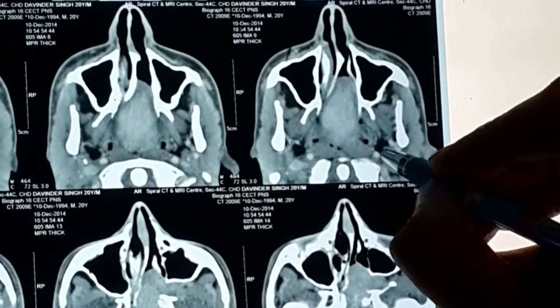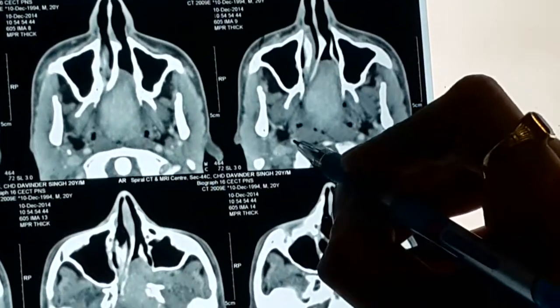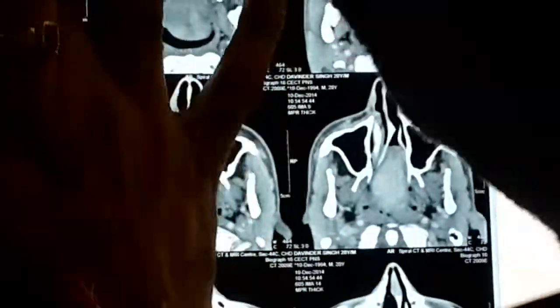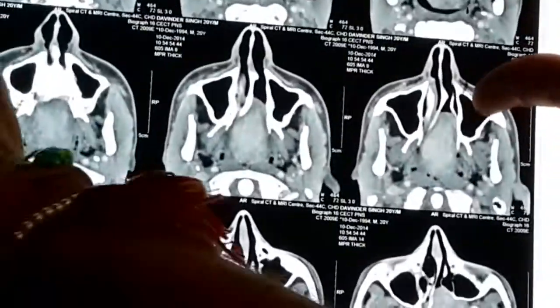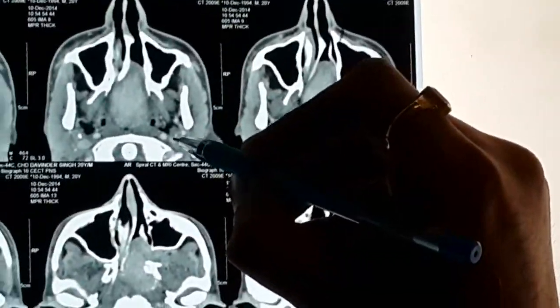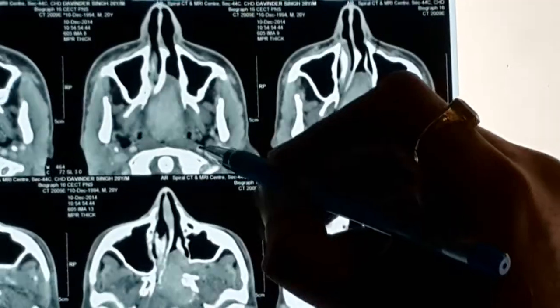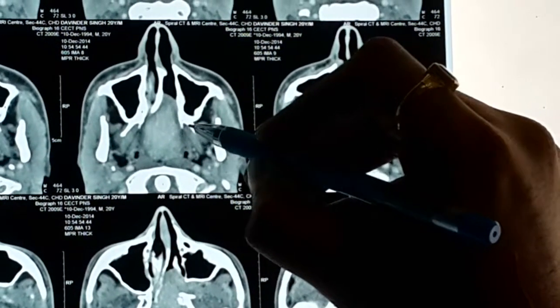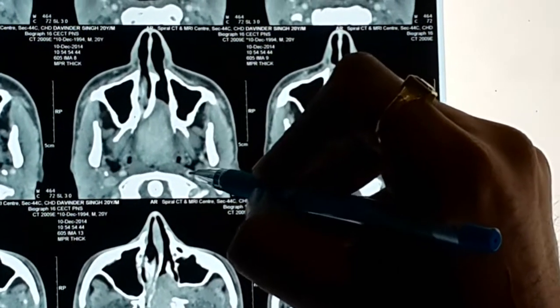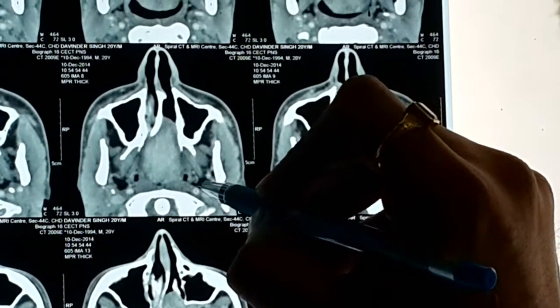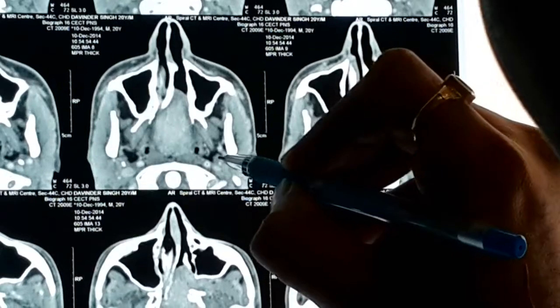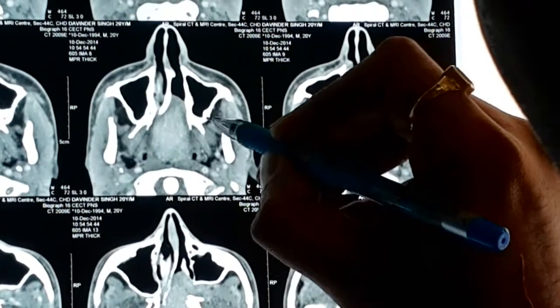Here is the carotid artery — both carotids. This is the jugular. This is the parapharyngeal space. The next case is the parapharyngeal extension. This is the jugular vein, this is the carotid artery, and this is the pterygoid process. There is no tumor behind the pterygoid process — that's the beauty in this case, that's the simple case I would call it. And in this, this is the infratemporal fossa.